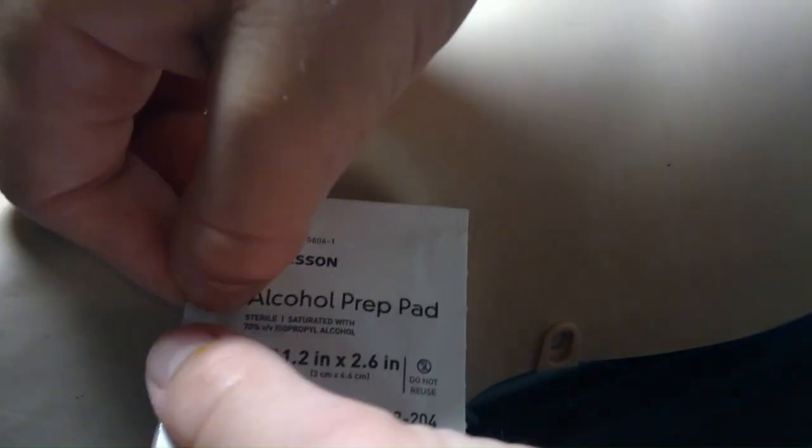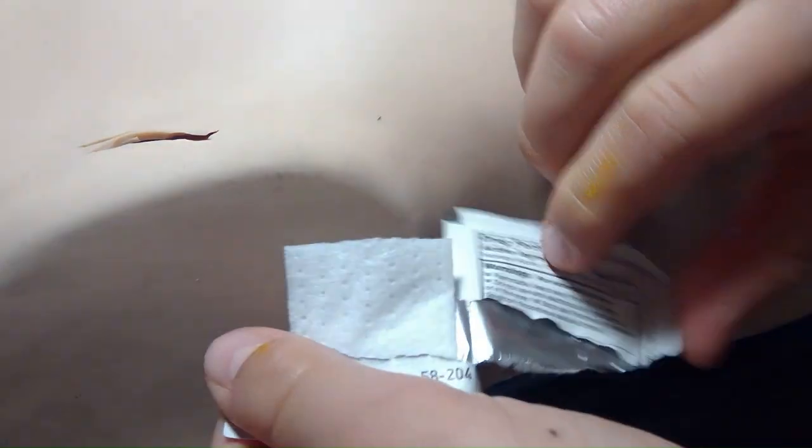First you're gonna take your alcohol prep pad, tear it down the middle like that, then you're gonna clean in a circular motion for 30 seconds right where you're gonna put the medication. Generally people don't clean for a full 30 seconds, but you just want to get it sterilized and nice and ready.